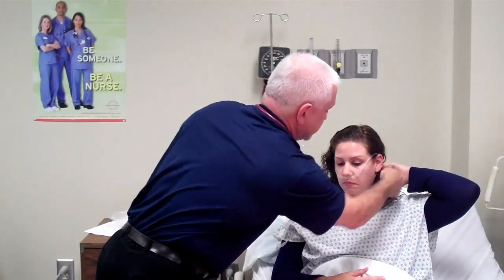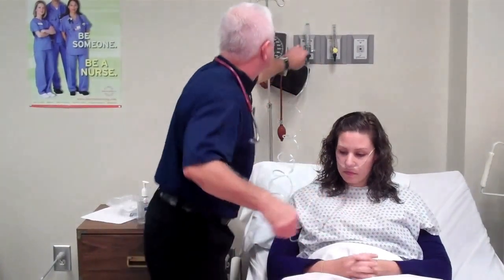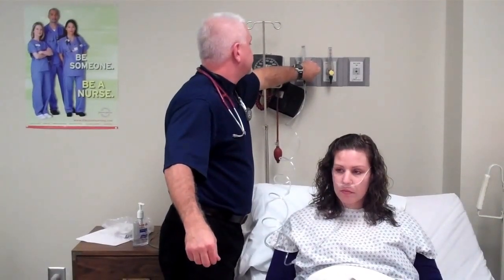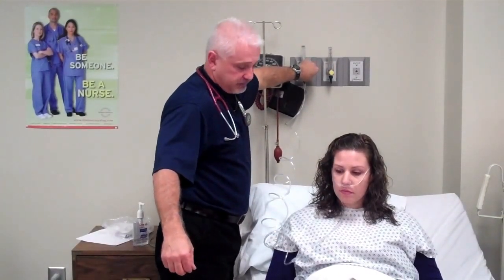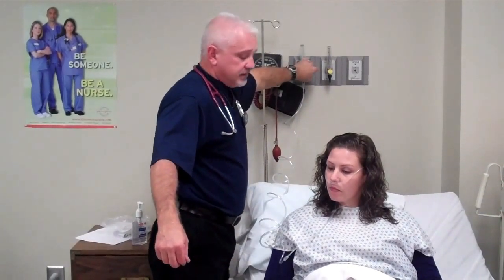Not all your patients are going to be as cooperative as she is. And now I would slowly increase my liter flow until I got to 2 liters per minute. You doing okay, Miss Hatch? Mhm. Okay, good. Okay, now she's at 2 liters per minute, and I'd say, how do you feel? I feel fine. You feel fine?